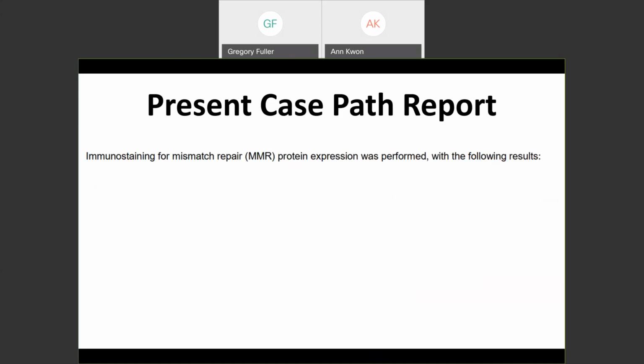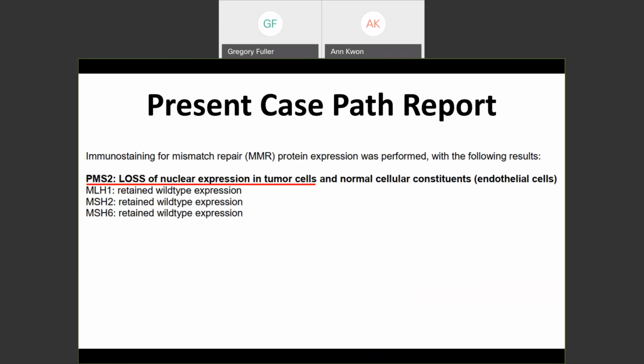But what did I do? The data wasn't there in NGS. So how did we make the diagnosis in this case? We did it with immunohistochemistry. Holy moly. When I looked at it and thought about it, the tumor looked horrendous. It looked like just the worst glioma, pleomorphic, et cetera. I thought, let's just look. Let's run the immuno. What happened?